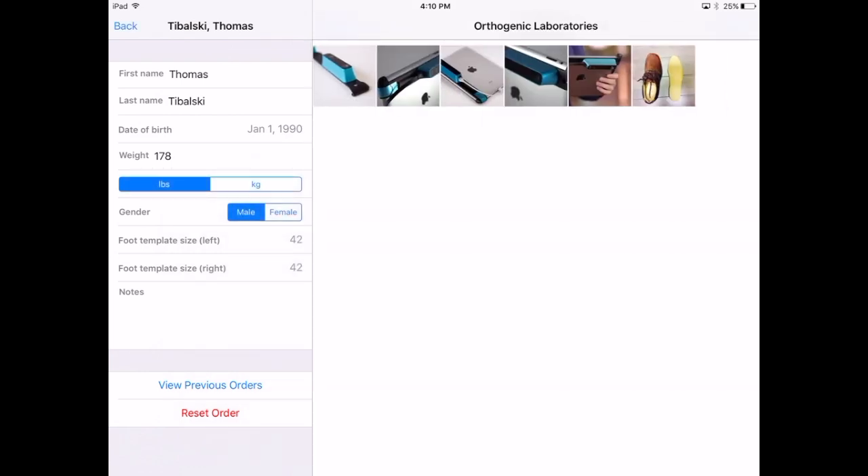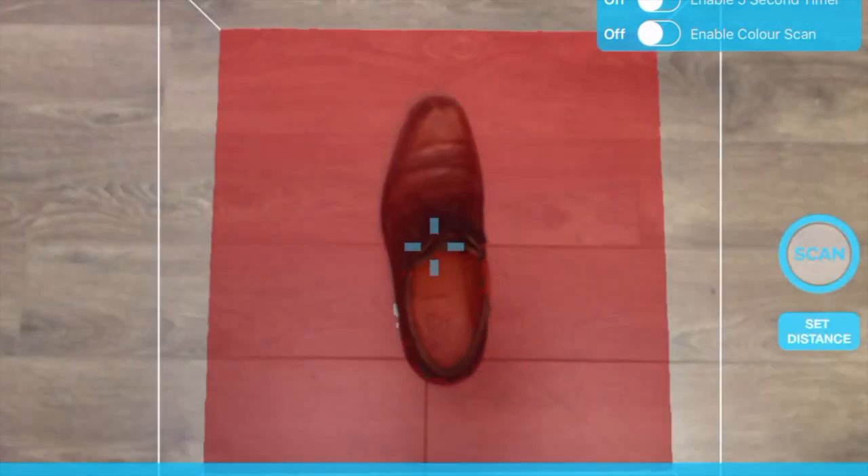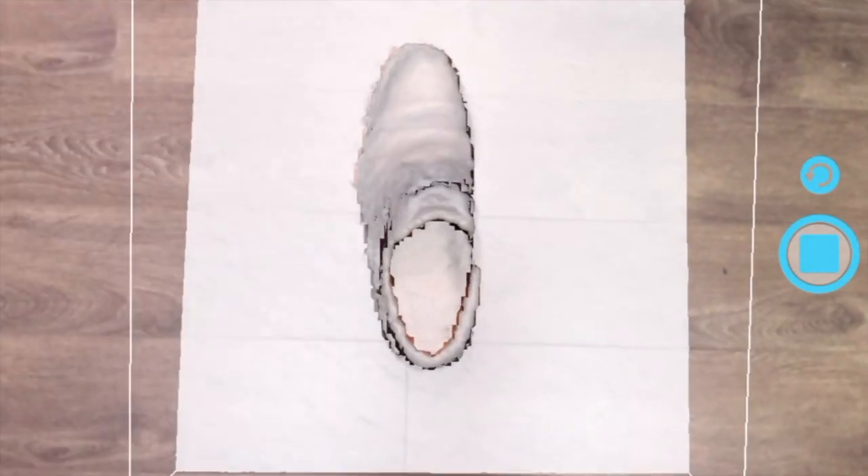Add photos, attach documents, and even take scans of existing orthotics or footwear to ensure no detail is missed.